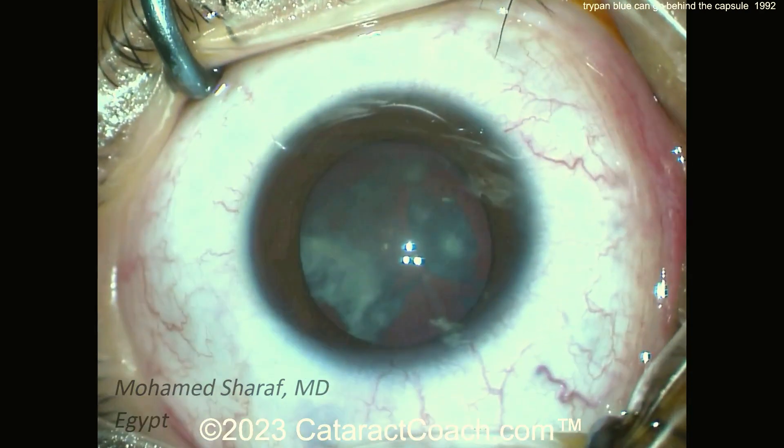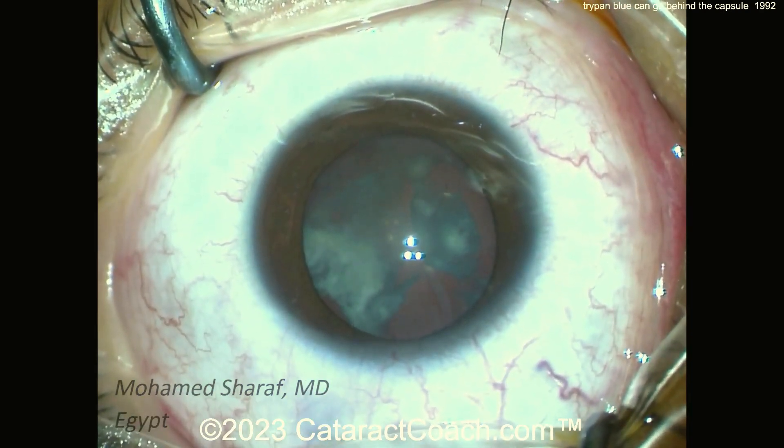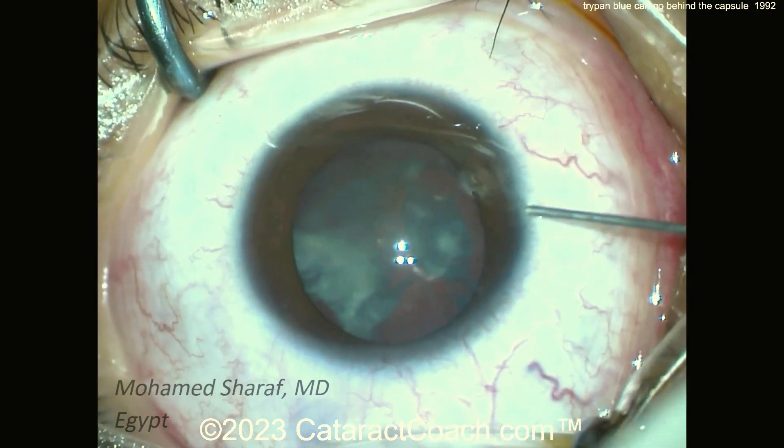Here's a patient who looks like a traumatic cataract, although the patient doesn't report trauma. Young patient, unilateral cataract.